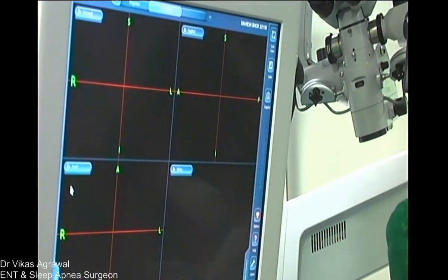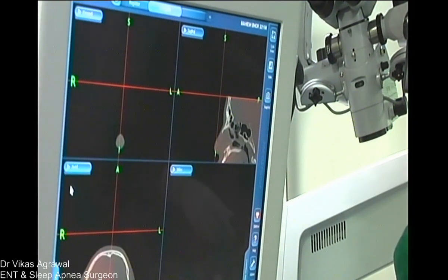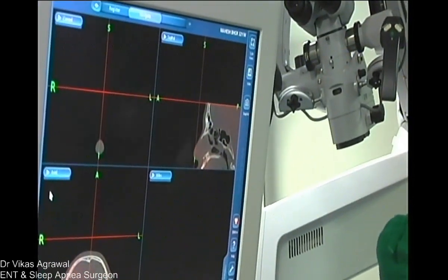Suction. It just takes a few seconds to align everything. Generally, it's a 2-minute job to align everything. Camera, endoscope. Now I'll take a 0-degree endoscope, and you can go to the endoscopic picture now. In fact, you can go PIP.